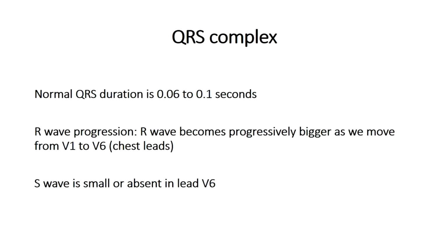As the ECG leads change the position from where they look, for example in V4, V5 and V6, which look at the left side of the heart, you're obviously going to see a bigger R wave, because those leads are placed over the left ventricle, and therefore will be measuring the electrical potential, or the vector of that potential, at its greatest point.